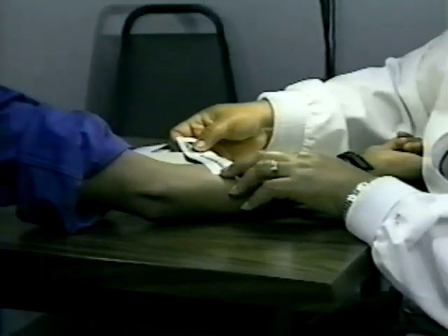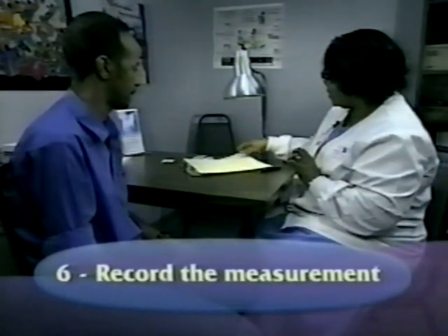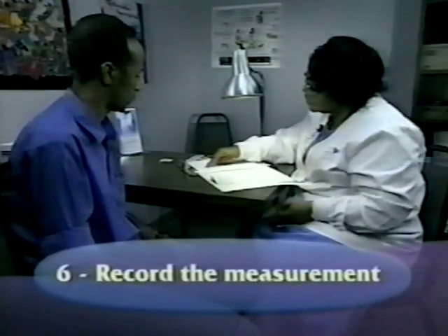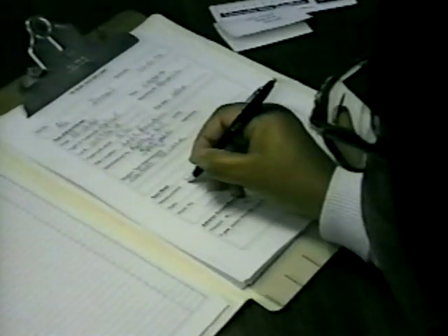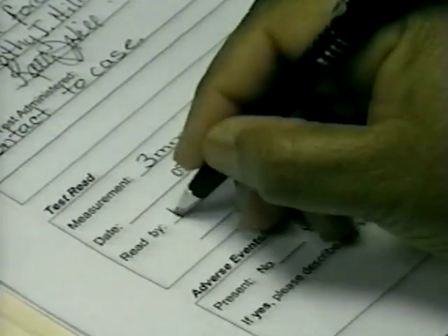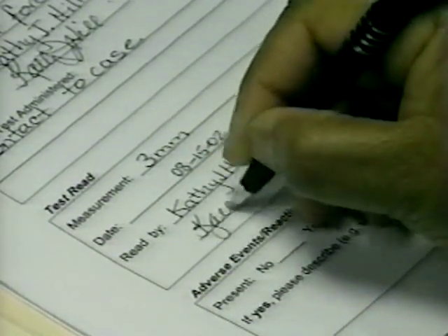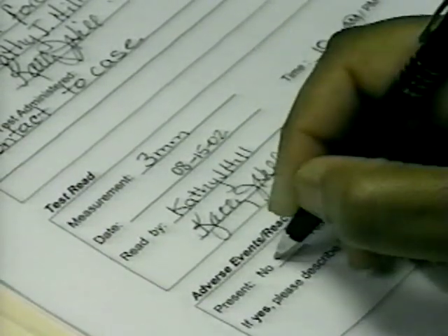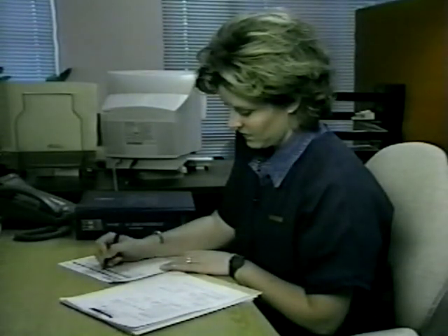Immediately after the test is measured, write the exact measurement in millimeters of induration in the patient's record. Do not simply record the interpretation as negative or positive, and do not record the results in centimeters. For example, an induration that measures 3 millimeters should be recorded as 3 millimeters, not as negative. Additional information should include the date and time the test was read, the name and signature of the person who read the skin test, and the presence or absence of adverse effects.